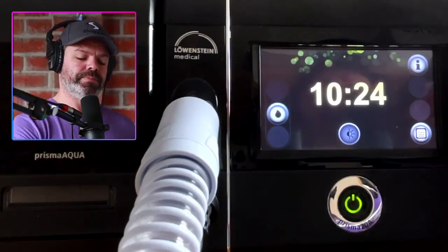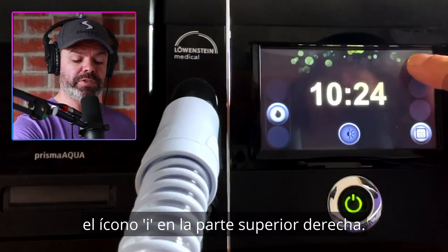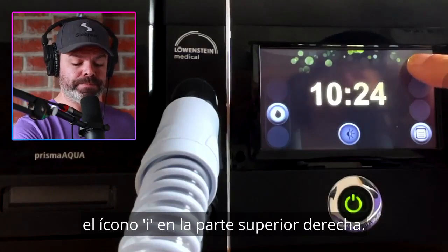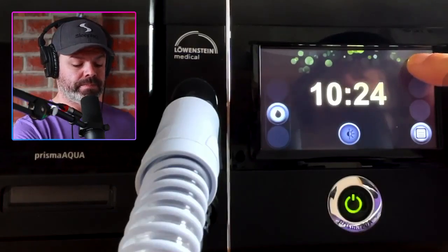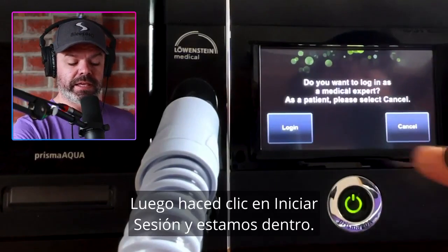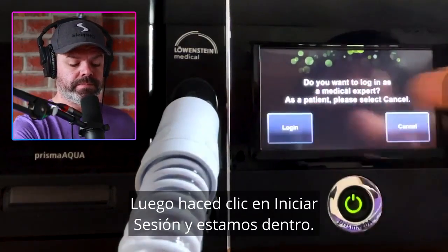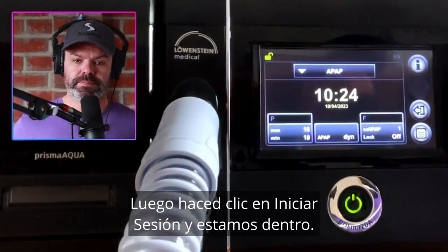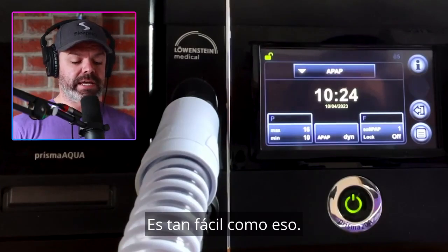To begin, click and hold the eye icon in the top right. Then click login and we're in — it's as easy as that.